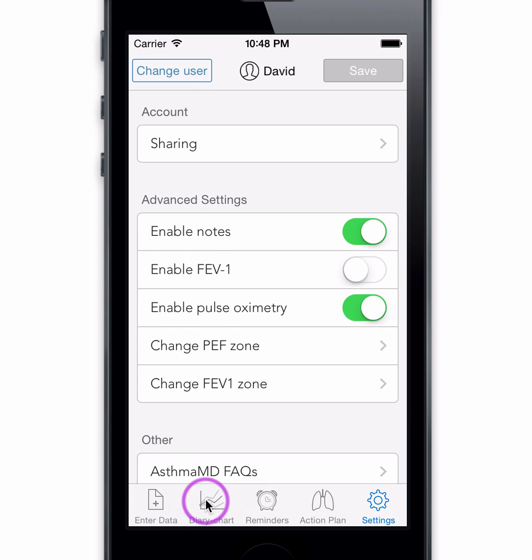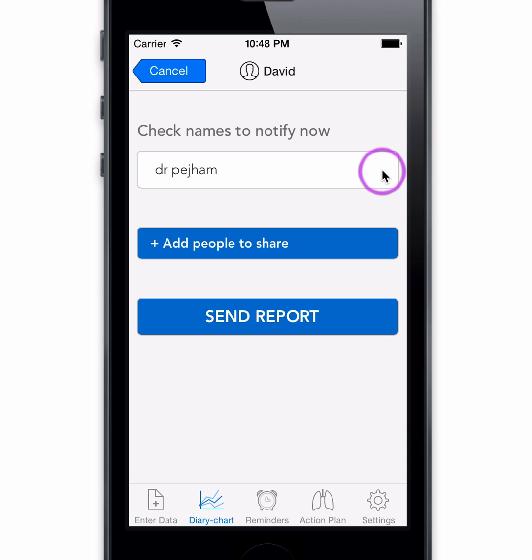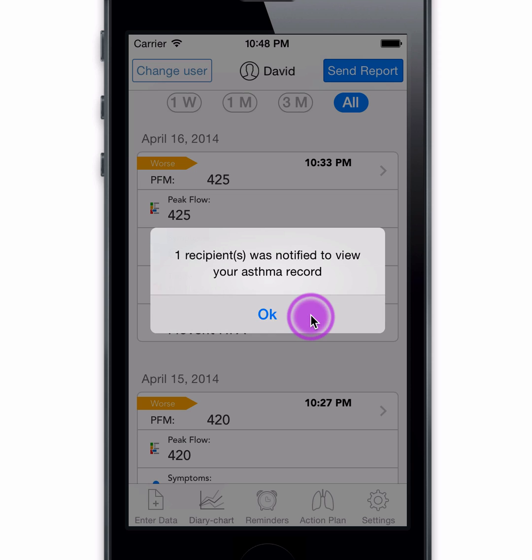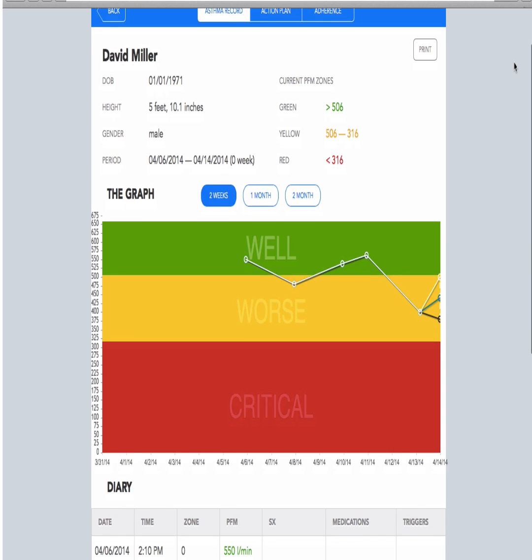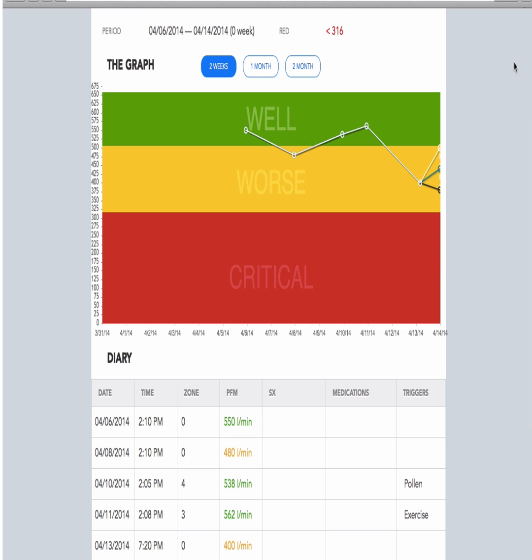To notify your recipient to view your asthma data via email, choose Send Report. You can pick your recipient from your list and press Send. The report is sent as a secure link via email. Your recipient needs to click on the link to get access to the report and sign in. We have strict security requirements to avoid unauthorized access to your data.